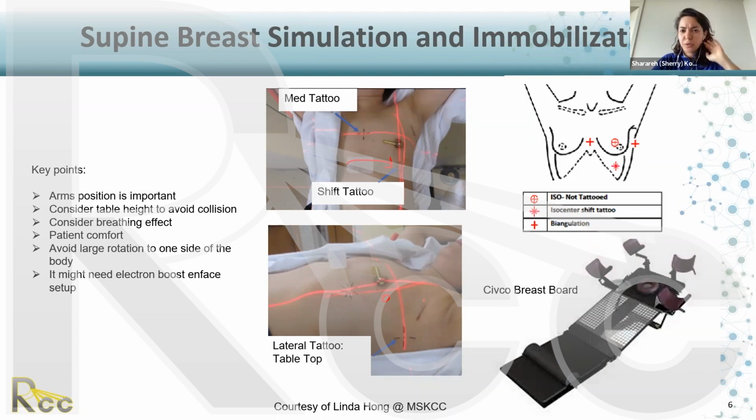And I'm not sure if there are more slides on breast treatment, but for sites that do not have gating techniques, they can either do free breathing, VMAT, or 3D plans. They're asking for your opinion on which technique is better and why. We know that with VMAT plans the quality of the plan may be better, but if you could share your thoughts on it.